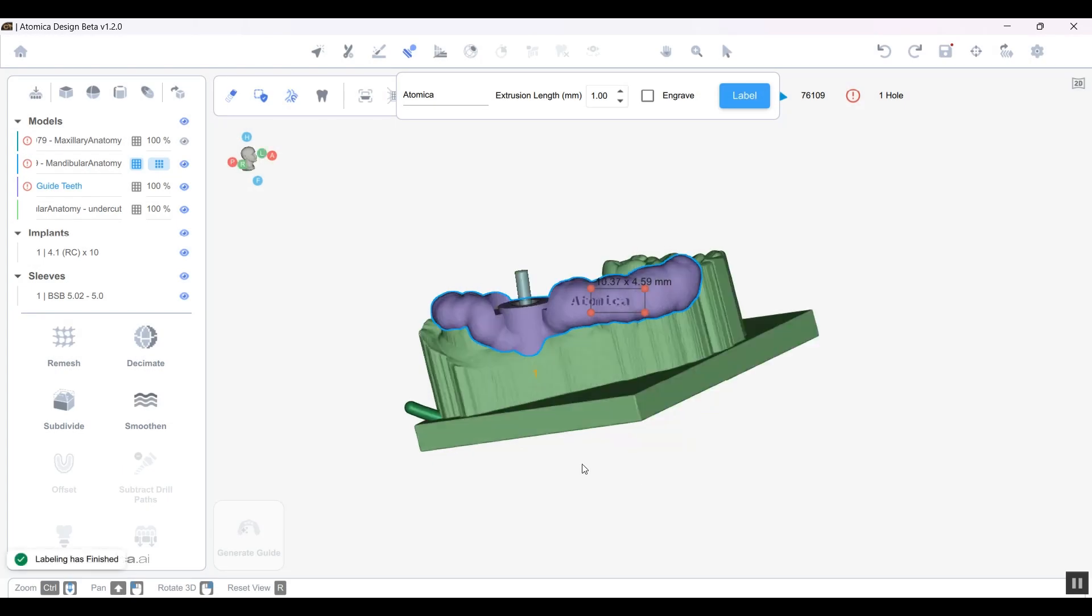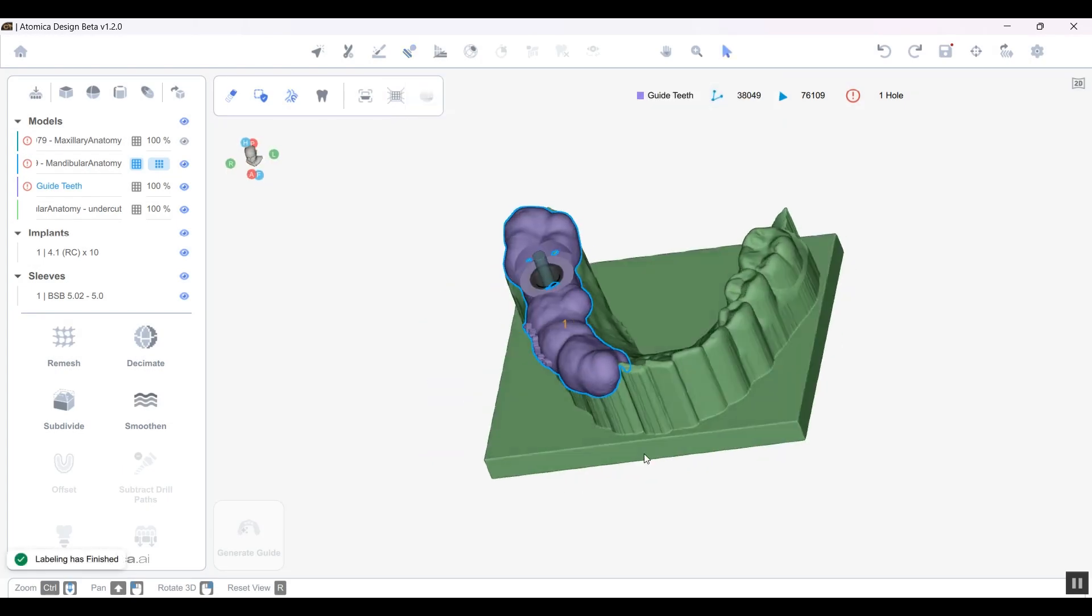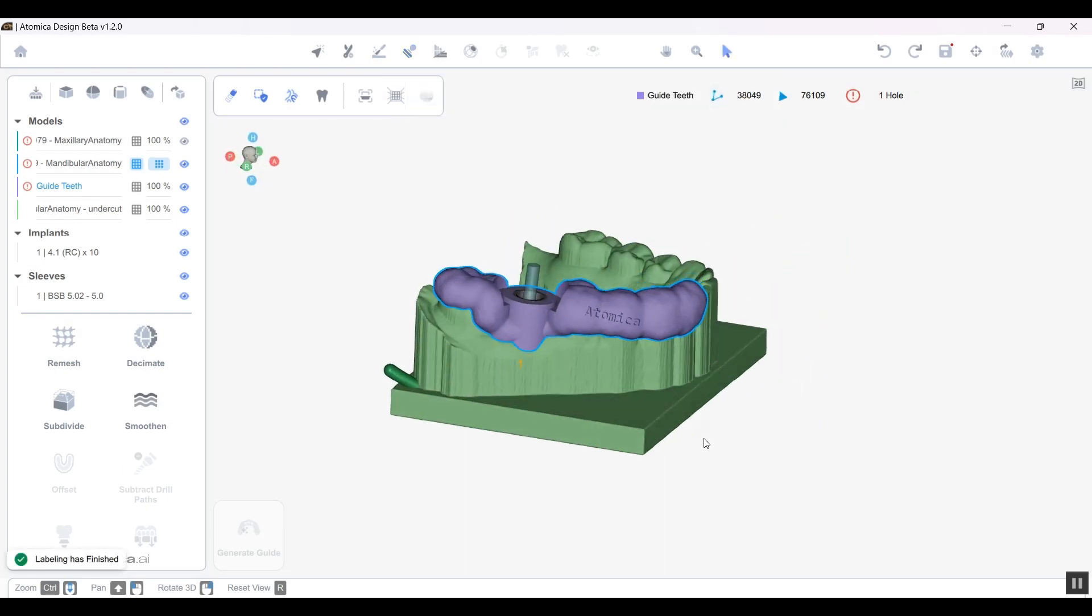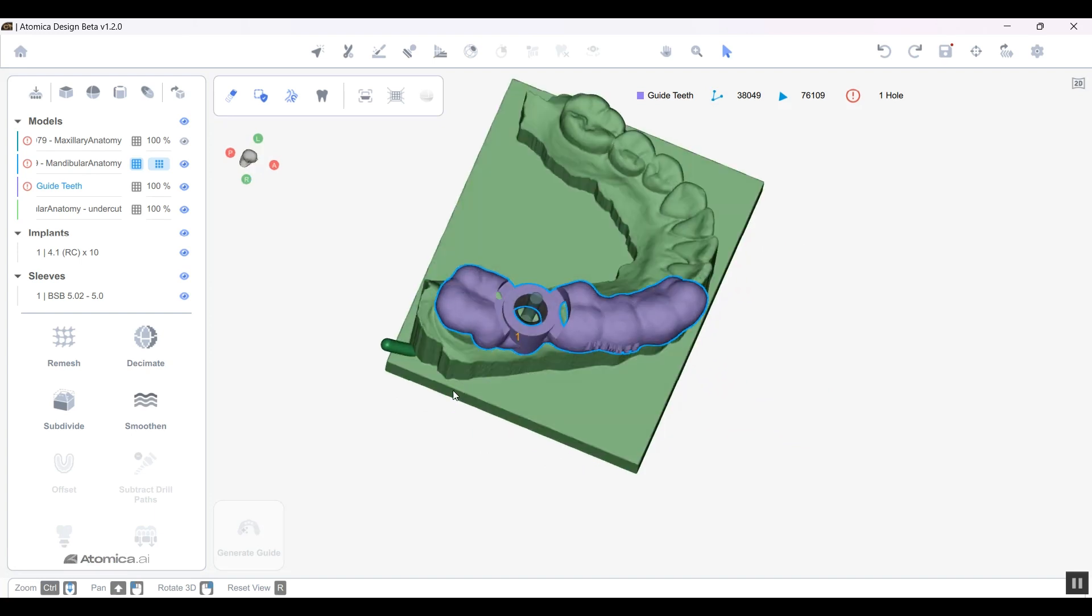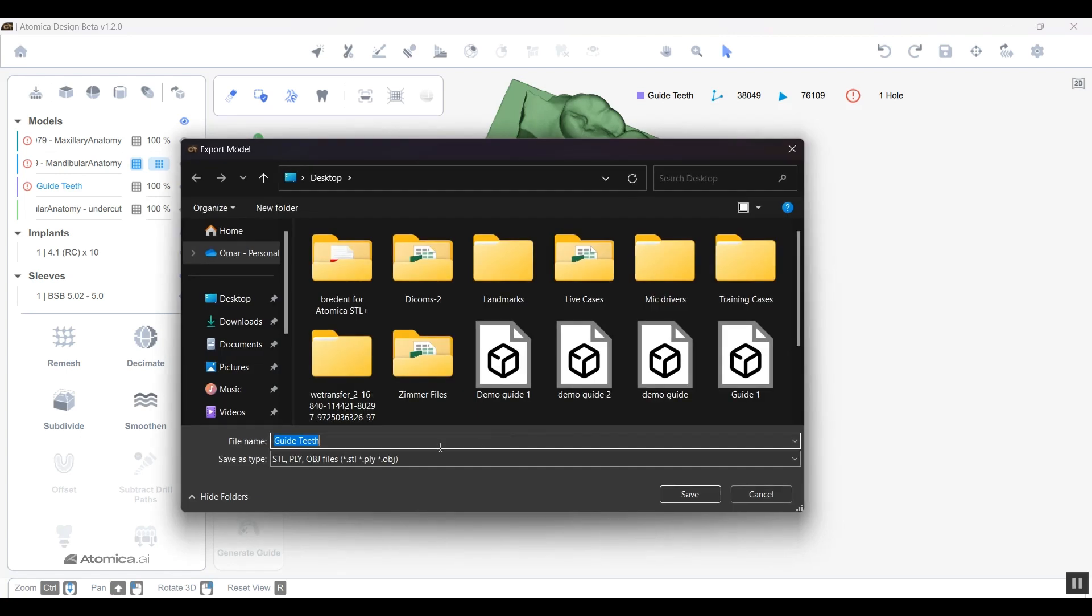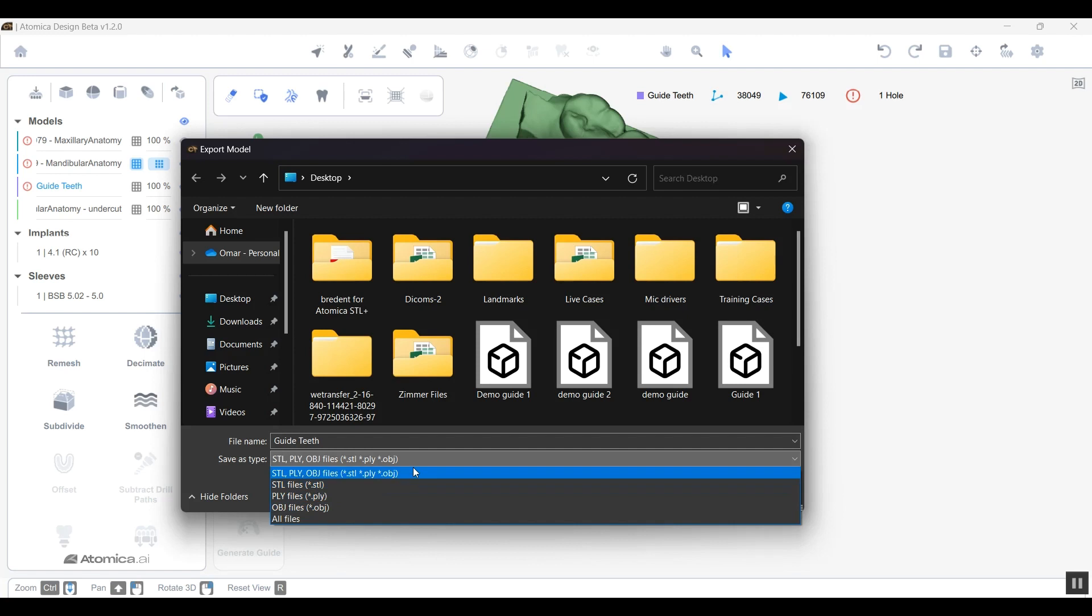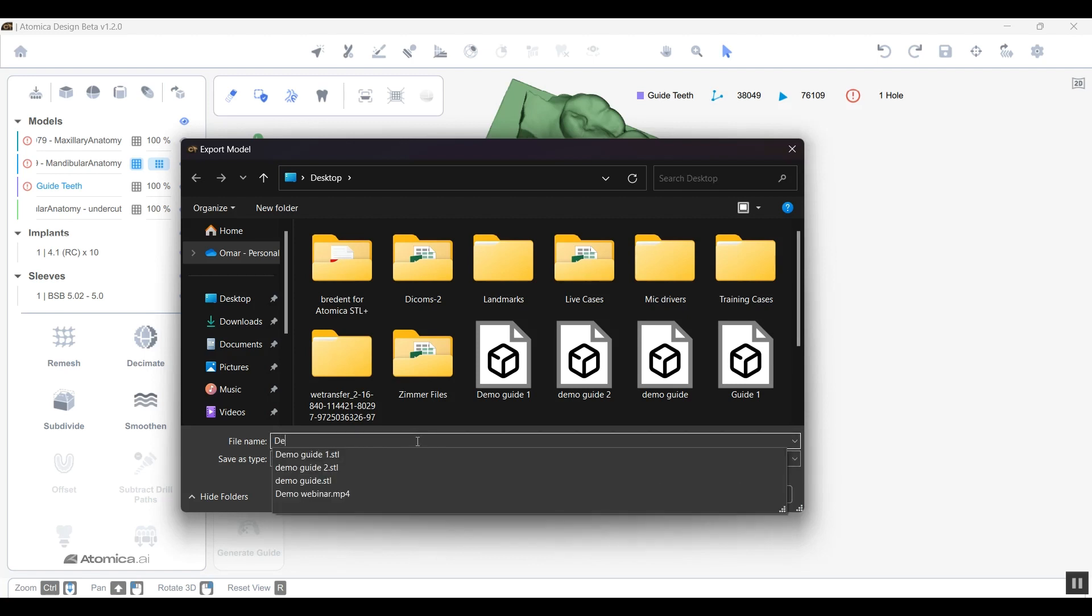Once you're done with that and you're happy with that guide and you want to start exporting, all you need to do is tap right-click and export. You can export into STL file, PLY, OBJ, and all you want.